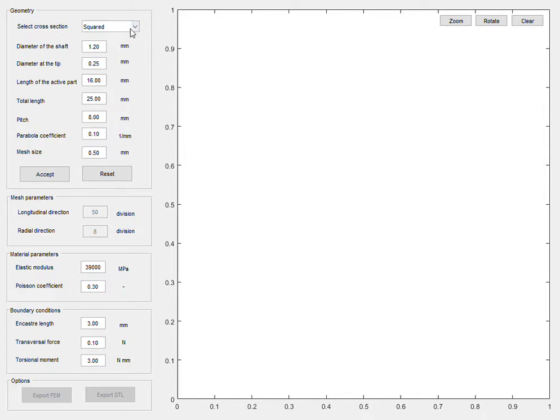First, we select the type of cross section. At this moment, we have a triangular and a squared cross section. And here we have the rest of the parameters that define the geometry. We have the diameter of the shaft and the diameter at the tip of the tool. We have the length of the active part and the total length for the rotary endodontic file.